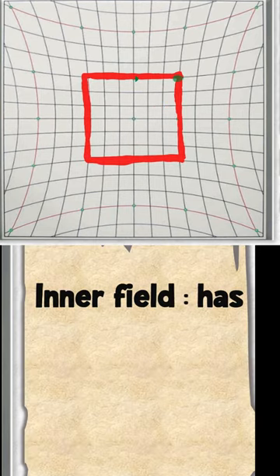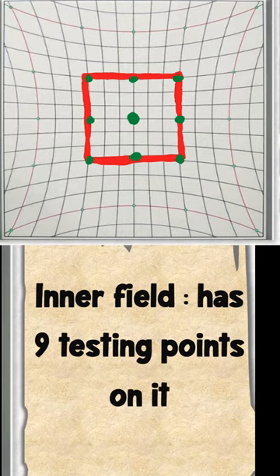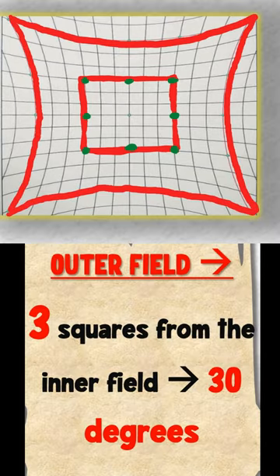This inner square actually has about nine testing points on it. Now let us discuss basically about the outer field.